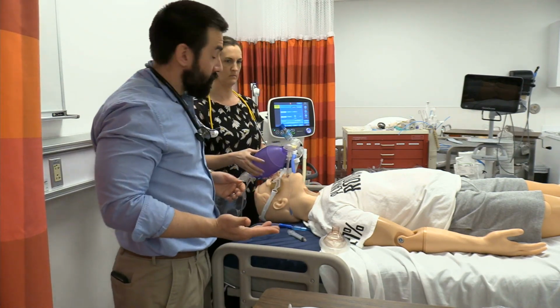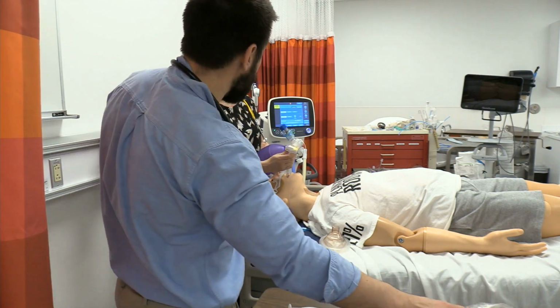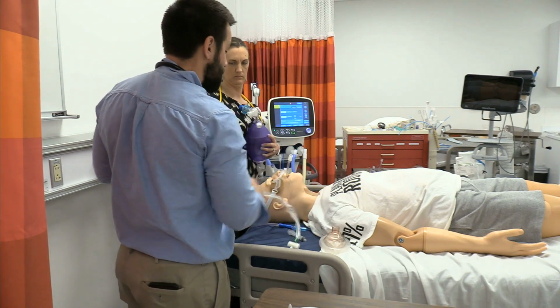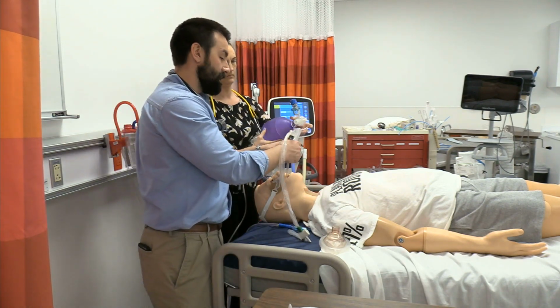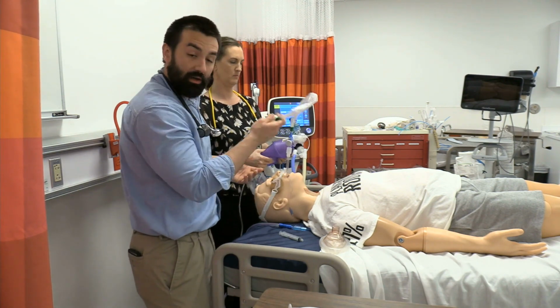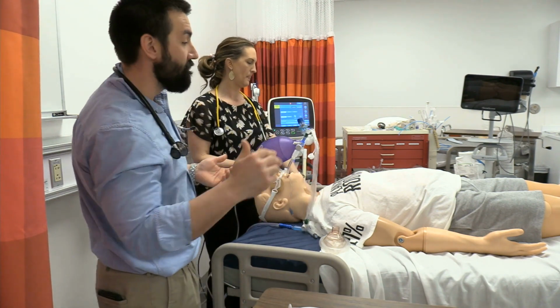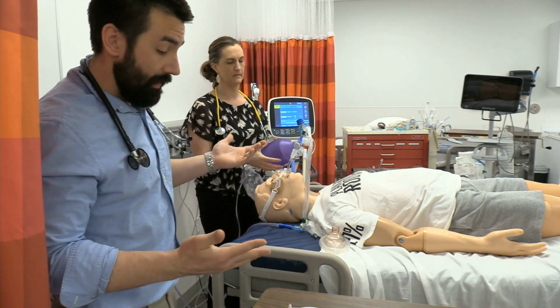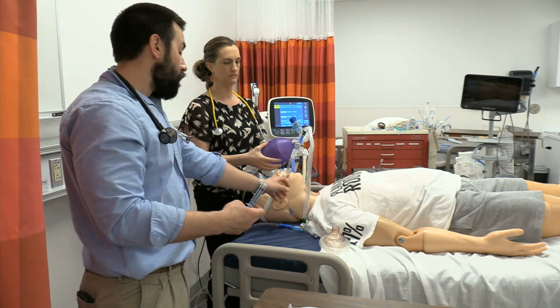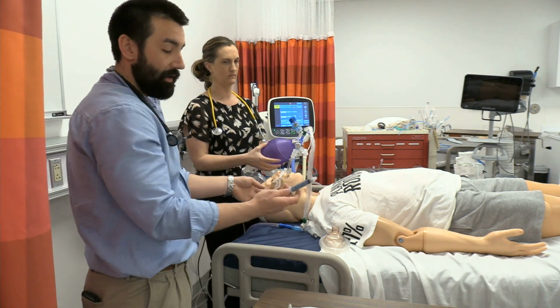So at this point, we could really go ahead and hook that patient up on the ventilator. We're not going to, because this guy has some extra appearing tissue on his chest right now. We'd hook the inline suction up, get it hooked up to suction if you needed tracheal suction and turn that vacuum down. Get him set up on the ventilator and go ahead and order a chest x-ray and confirm that depth. Before we do all that, I'm going to go ahead and check the cuff pressure here.